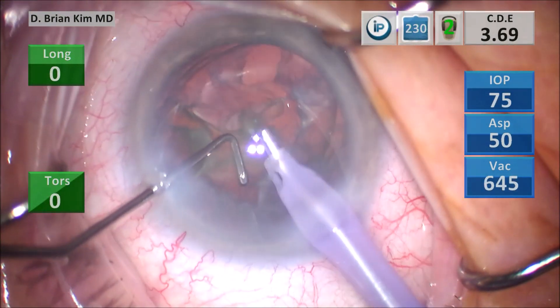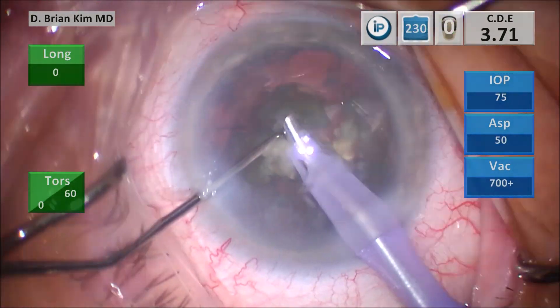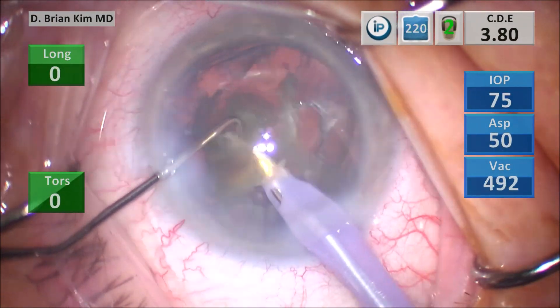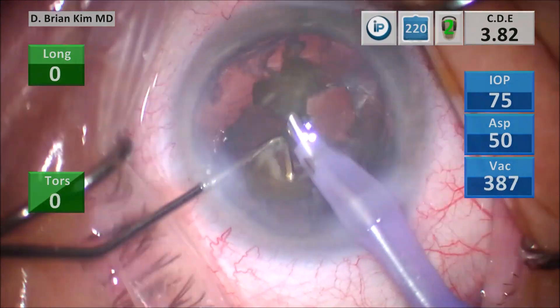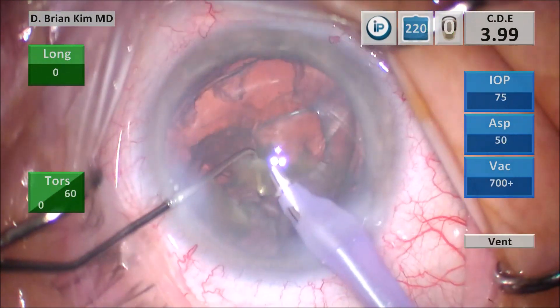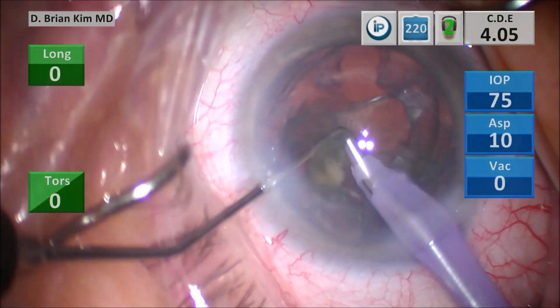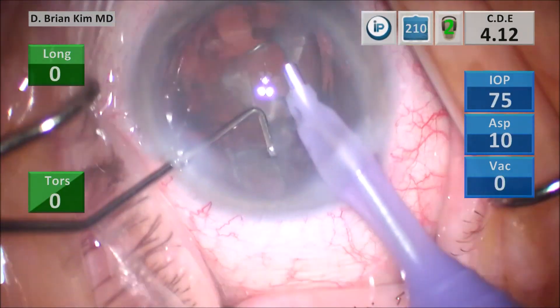You can see the last fragment here — I'm placing the chopper around the lens piece, crushing it between the chopper and the phacotip, and then using high vacuum and ultrasonic energy. When you're on the last quadrant you want to be very careful and use mechanical fracturing forces, which reduces post-occlusion surge. It also ensures that your chopper is deep between the bag and the phacotip. Now all the endonucleus is removed and I'm going to start to remove the epinuclear material.